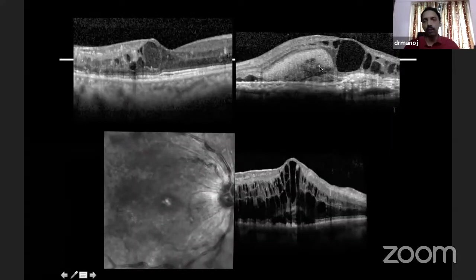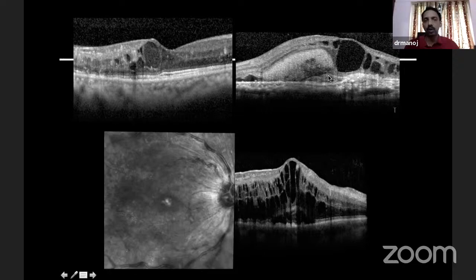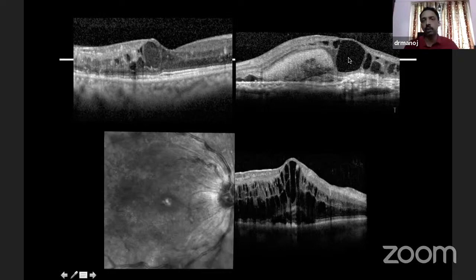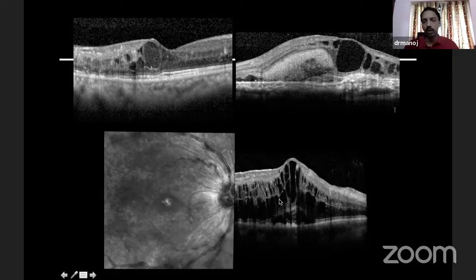Then you look at hyporeflective areas. These are examples of hyporeflective areas — generally called cysts, which contain fluid. Some cysts may have some content; these are called turbid cysts. The cysts are usually present in the plexiform layers, but sometimes you may see them in different layers, as you can see in multiple layers in this picture.